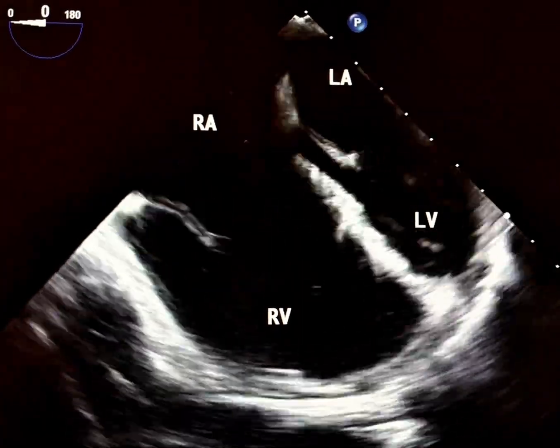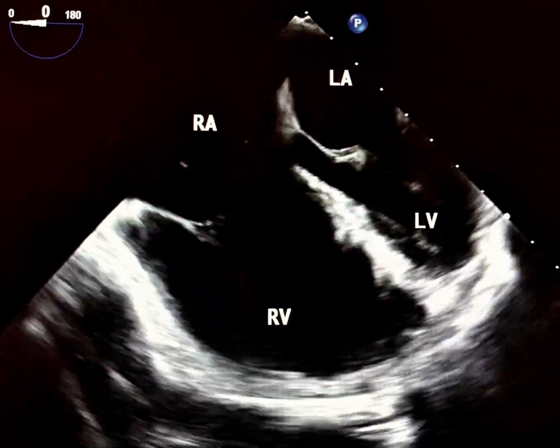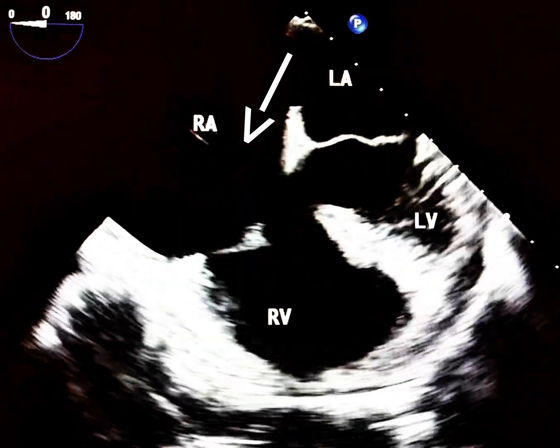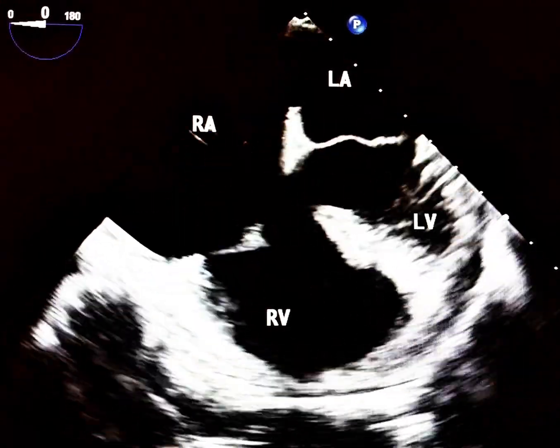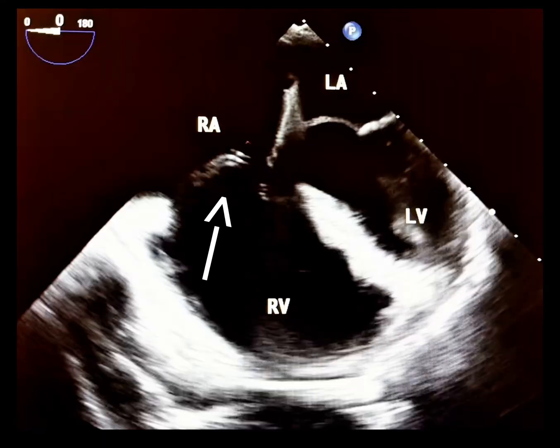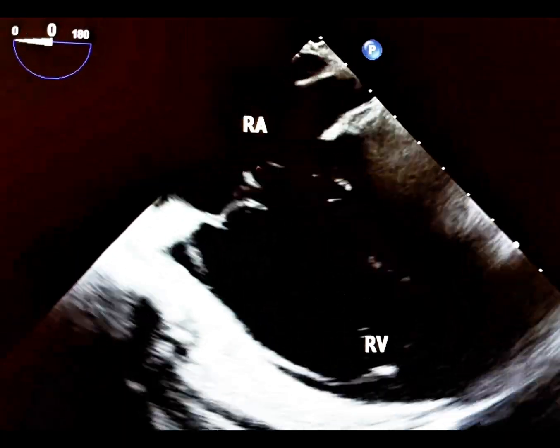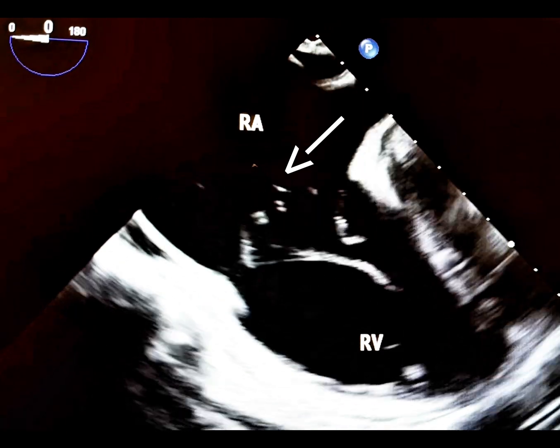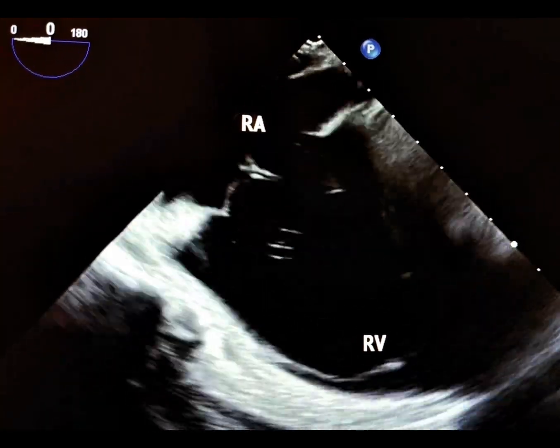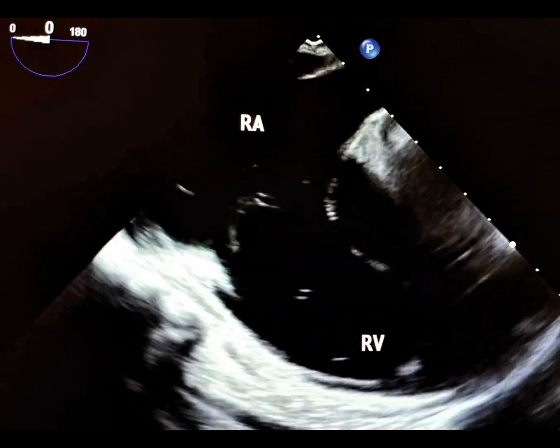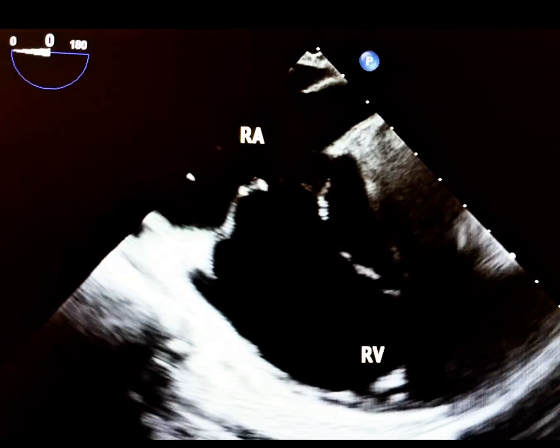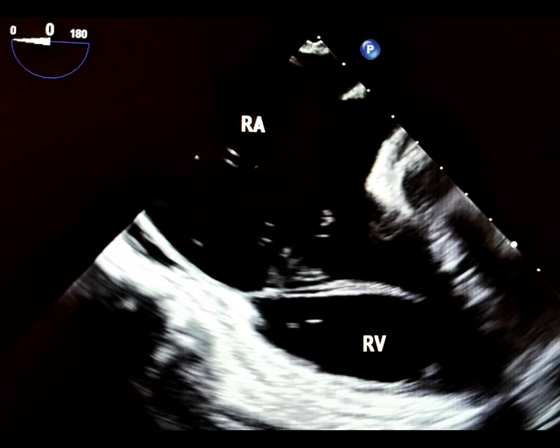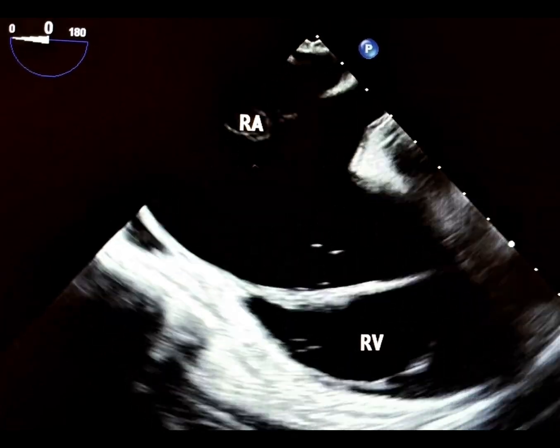Let's delve into the transesophageal echocardiographic views. This tricuspid valve (TV) view shows a flail anterior tricuspid valve leaflet. Blunt chest trauma, such as from accidents, sport, or occupational injuries, can cause rupture of the tricuspid valve chordae, papillary muscles, or leaflet avulsion, often affecting the anterior TV leaflet.